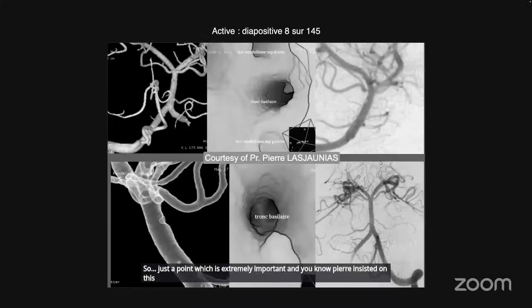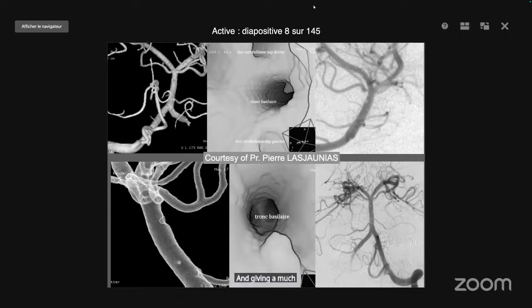Quite a long time ago already, at the very beginning of our 3D picture acquisition, it was absolutely necessary to try to screen the inside of the vessel. The surface rendering reconstruction was extremely useful and gave a much better understanding compared to what we had before this technology.